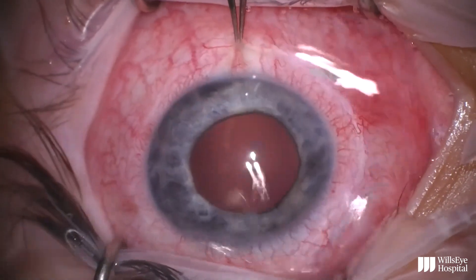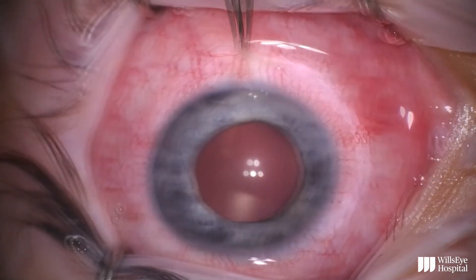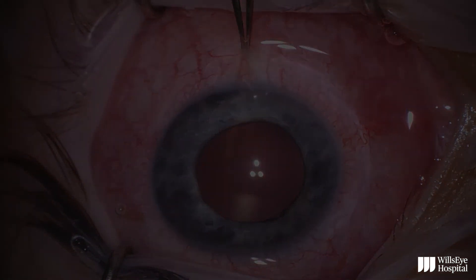I do use one bottle of balanced salt solution to irrigate the ocular surface. At the end of the case, I place a soft bandage contact lens on the surface of the eye and start the patient on antibiotic and steroid drops. Thank you.